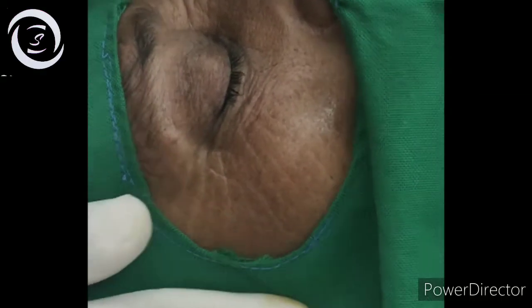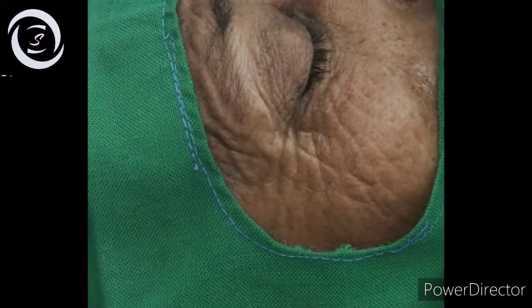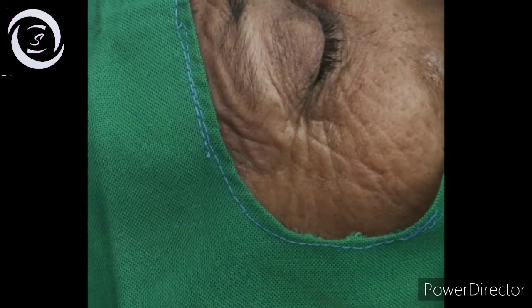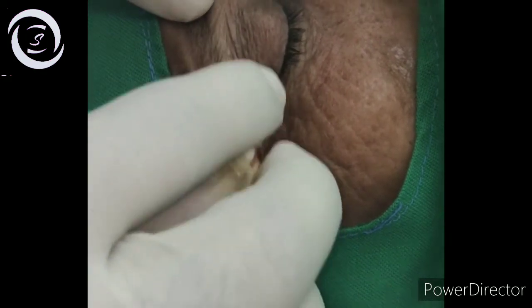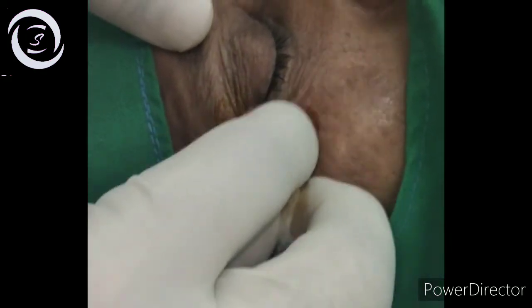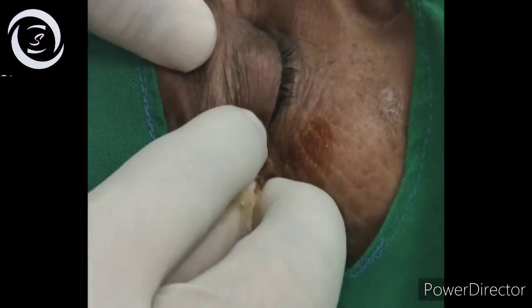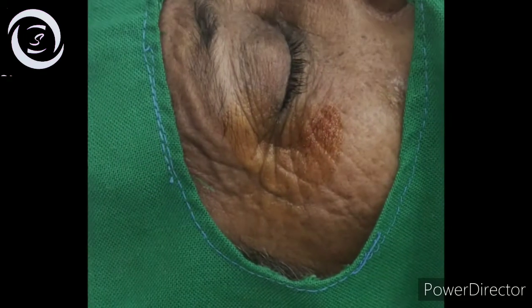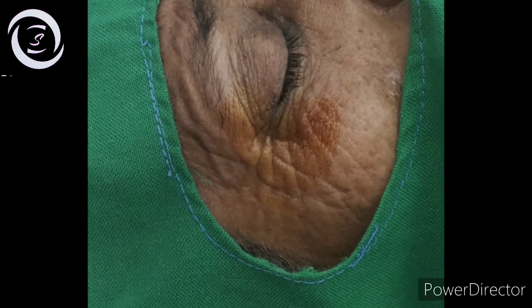In this video, I would like to show you the ideal technique of the modified Van Lint facial block. Place the patient in supine position, fill the BD syringe with 4 ml local anesthetic, and clean the area to be injected with povidone-iodine soaked swab.